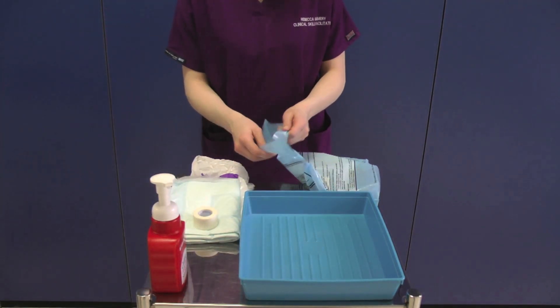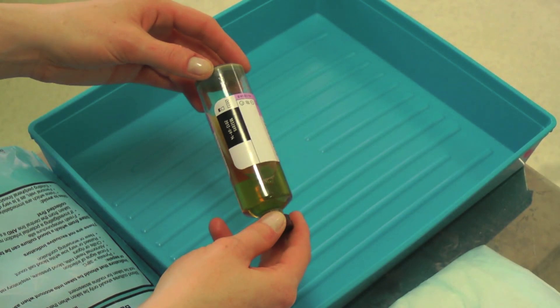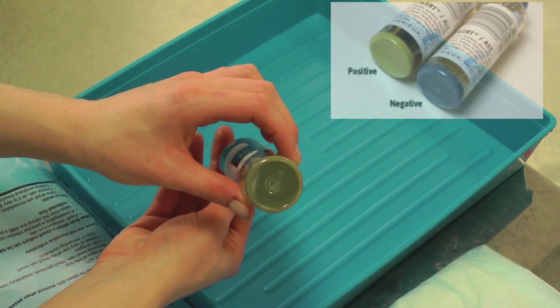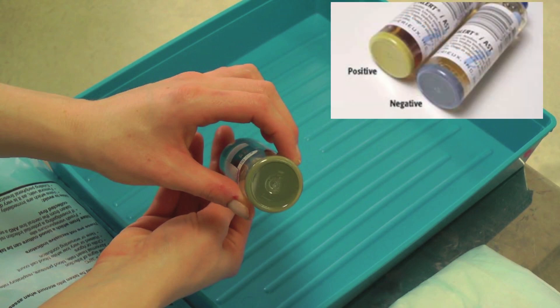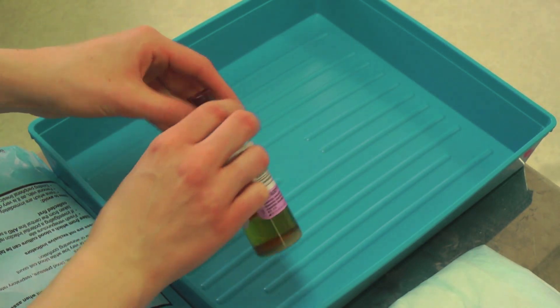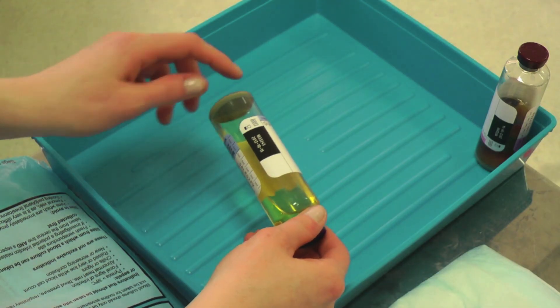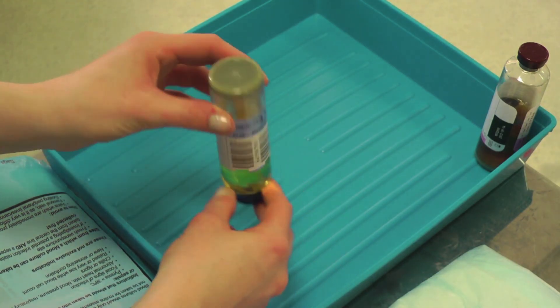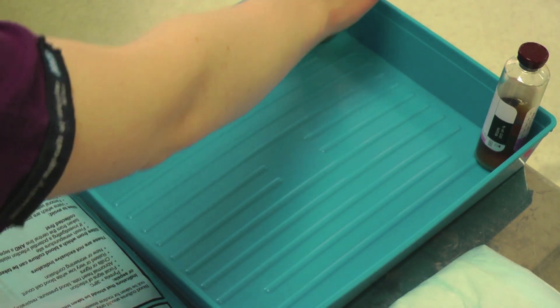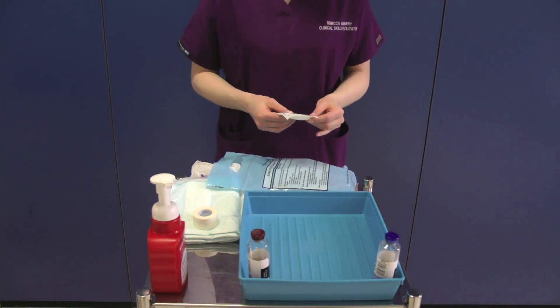Open the blood culture pack and arrange your equipment in the tray ensuring all key parts are protected. Check the expiry date on the blood culture bottles — there is a barcode that must not be removed. Also check for contamination, which is indicated by a yellow discolouration on the bottom of the bottle. There is a millilitre scale on the side of the bottle to help you take the correct amount of blood. Repeat this process for the other bottle. Remove the rest of the contents of the blood culture collection bag, checking the expiry dates of the equipment when appropriate.